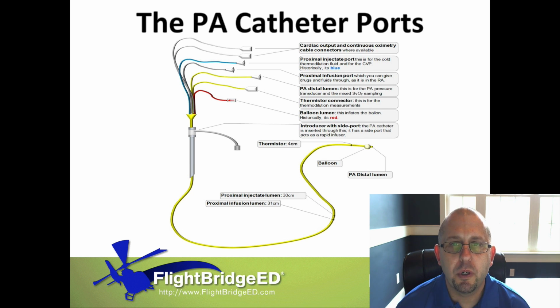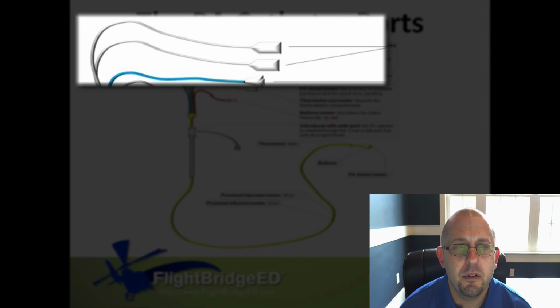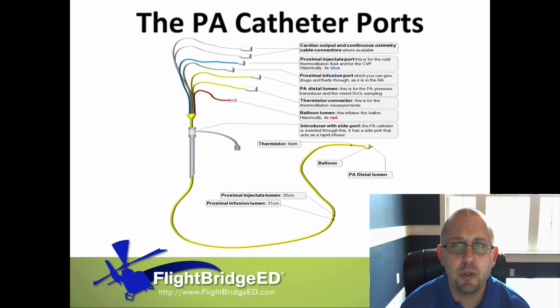We have multiple ports, like I said. The very top two ports are in white. Oftentimes, there's a red cap and a blue cap. Those two are used for your monitor connection. And then the blue cap, the cardiac output aspect, is used to identify a consistent cardiac output.